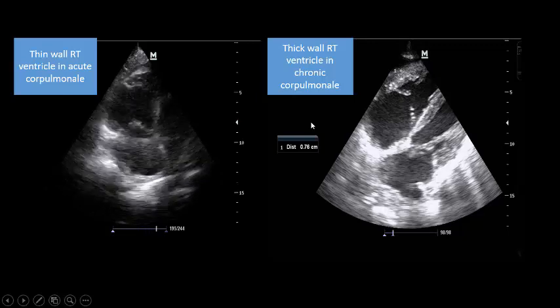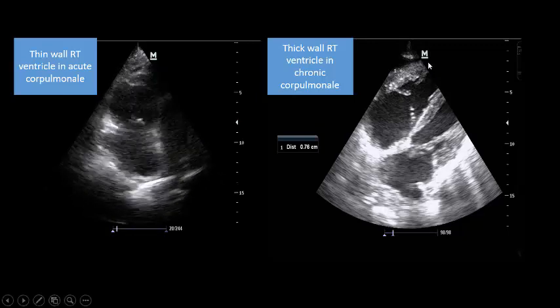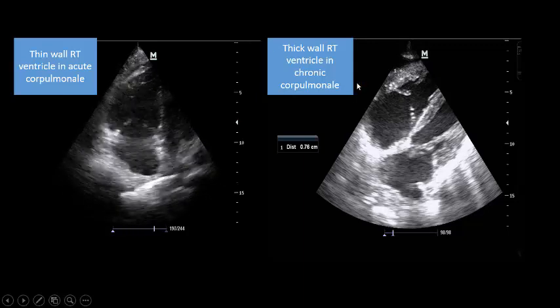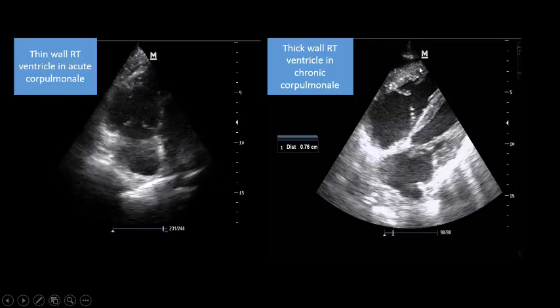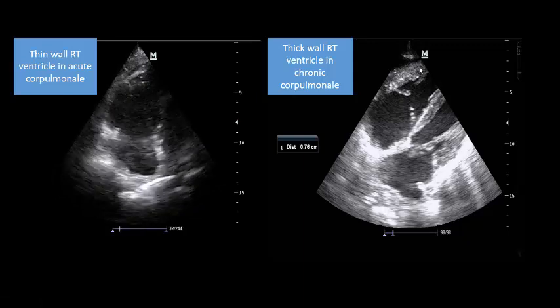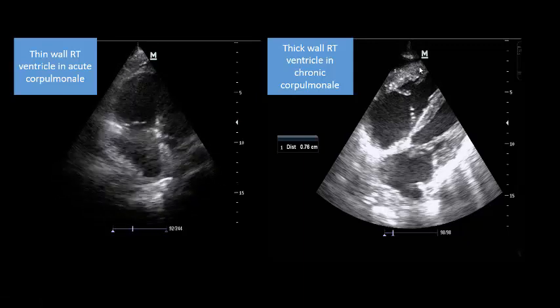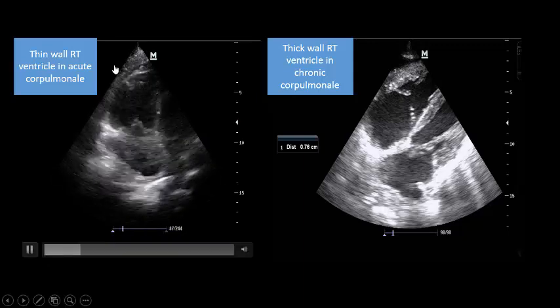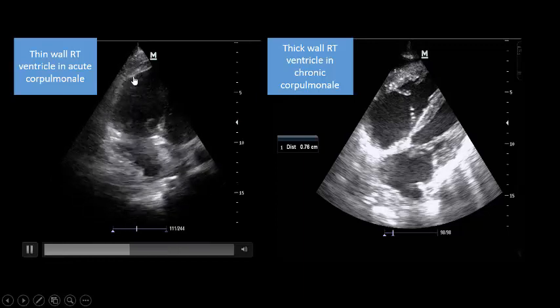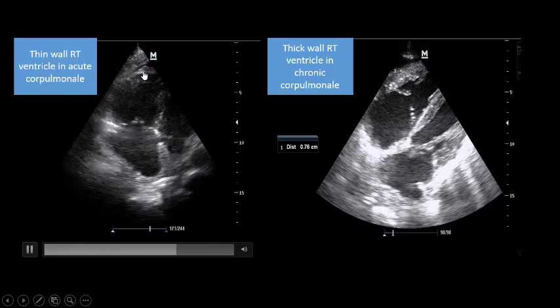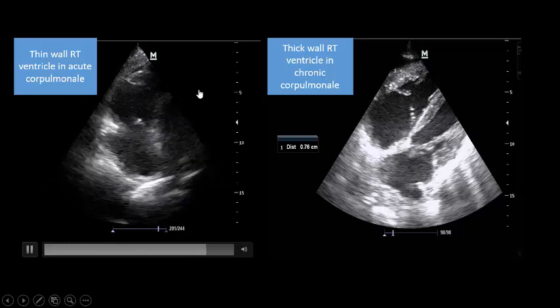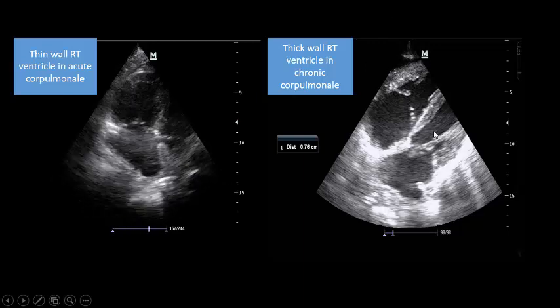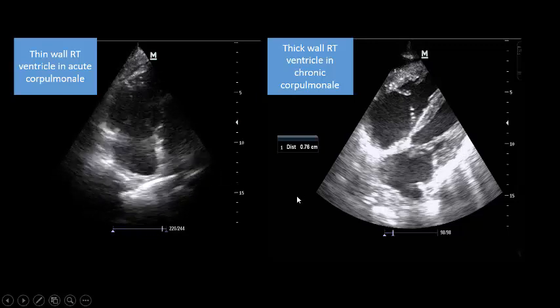With time, the right ventricle compensates by increasing wall thickness and muscle mass. In chronic cor pulmonale the RV wall becomes thickened — it may take approximately two weeks to begin increasing in thickness, but over time the wall becomes significantly thick. In contrast, in acute cor pulmonale due to pulmonary embolism, the wall is thin because it has had no time to compensate. In chronic cases the compensated RV can become as strong as — or even stronger than — the left ventricle, as you can see clearly here.